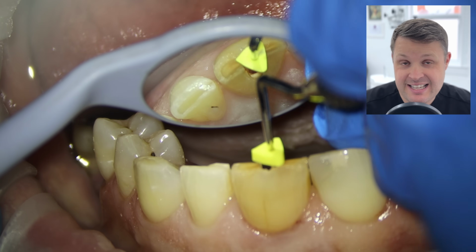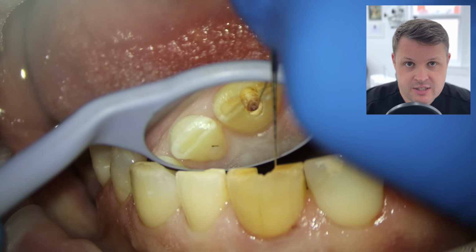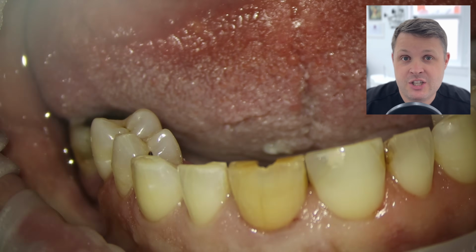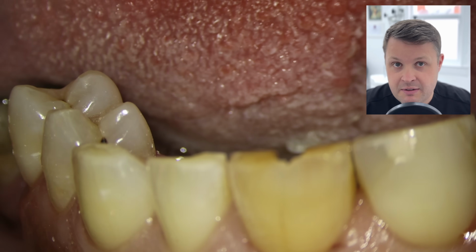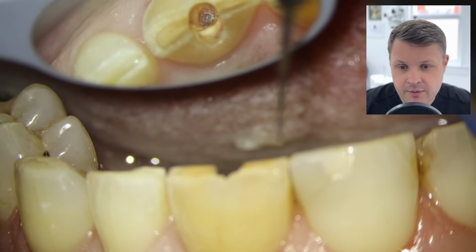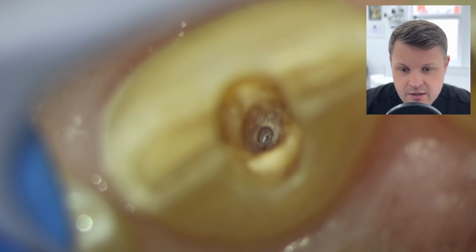And this is the bit where it's really, really difficult, because if you are at the right depth, as you see on the cone beam CT scan, and you're not feeling any orifice, it might be an indication that you're in the wrong orientation. And I suppose on reflection, maybe I should have taken a cone beam CT scan at this point, but I have a feel around with my hand files, and I have another little feel around with the diamond-tipped ultrasonics, and I feel like at this point here I'm straight down the center of the tooth. I feel like there is a bit of darkness here.